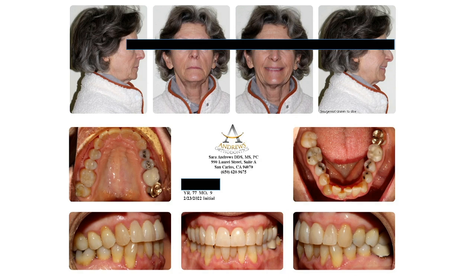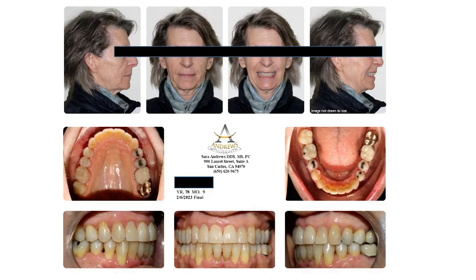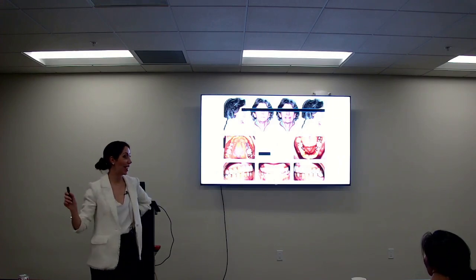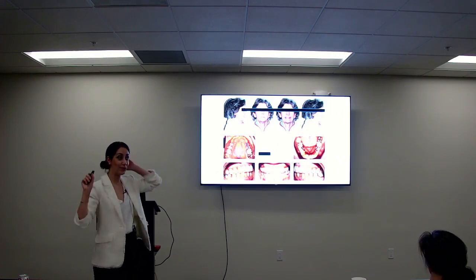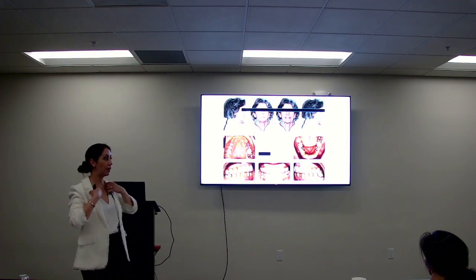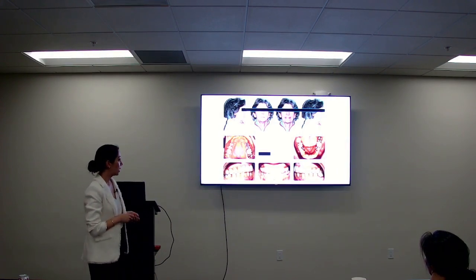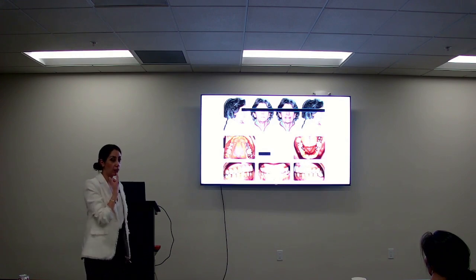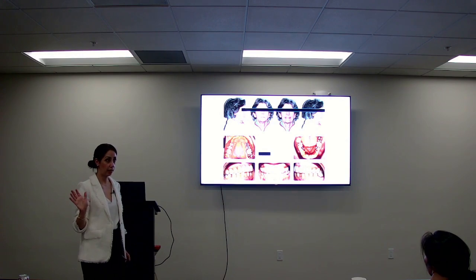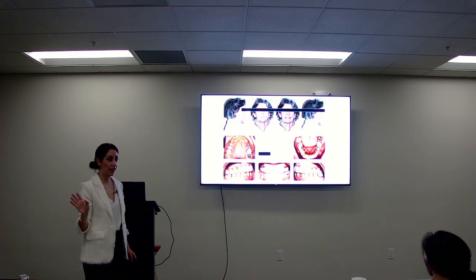Again, look at that arch form. It's like lingually tipped mandibular molars, pretty severe crowding and gingival recession. So some people would look at this and be like, oh, I'm going to take out a lower incisor. I absolutely do not. I never take out a lower incisor. I do not like that plan at all, basically for anybody. The only time I will do that is if somebody has a lower central incisor that's just hopeless, and a dentist needs to take it out. Like, okay, I'll close that space, no problem.